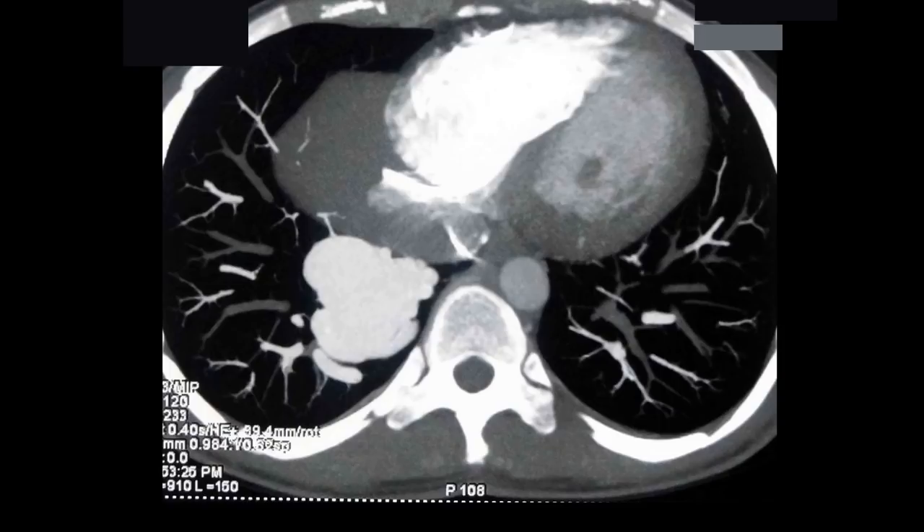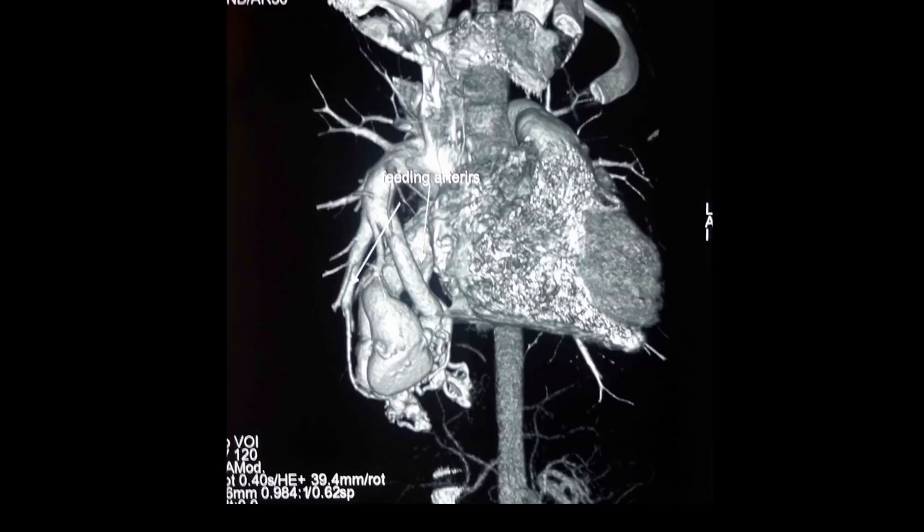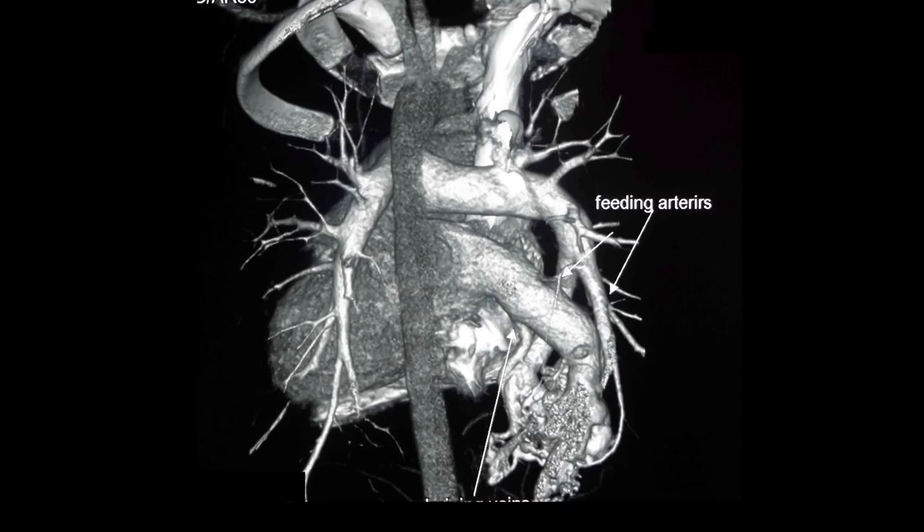He was investigated and on imaging we found a large arteriovenous malformation in the right lung — specifically the lower lobe of the right lung. As you can see, it is occupying a large part of the lung, and the CT showed the feeding arteries and the draining veins.